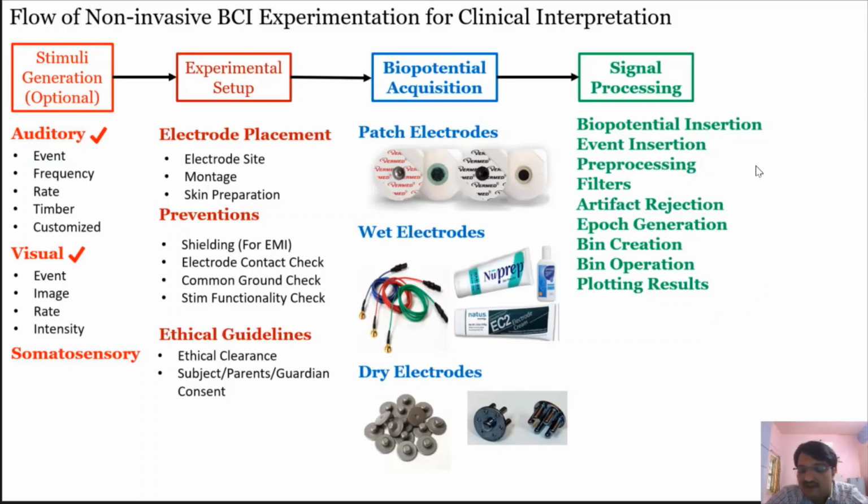Baseline is nothing but your normal ongoing EEG, which has a very small amplitude without too much activity. It is basically an average value of ongoing EEG. So you can get rid of this kind of artifact, and there is a provision to mention this range. This way you can reject the artifact.